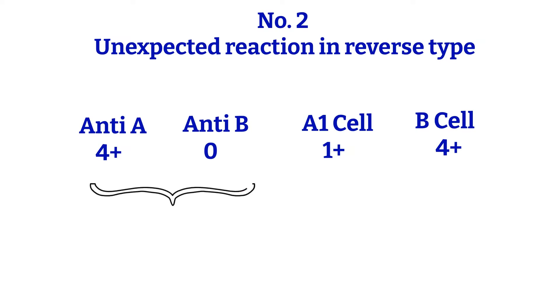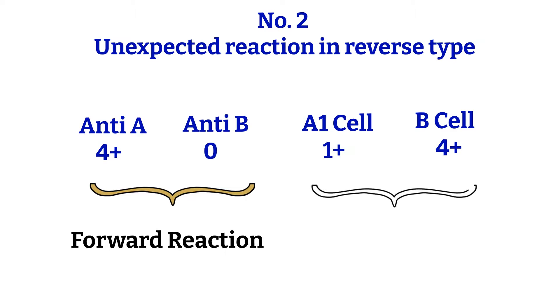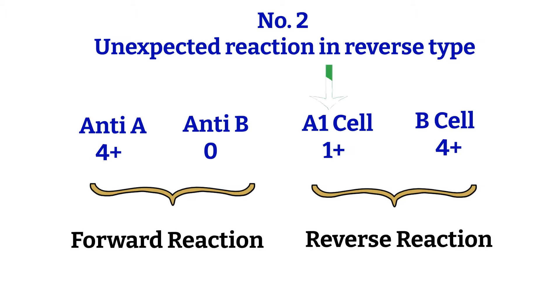I'll give you some hints. First, determine: is this a forward or reverse issue? Looking at the given reactions, you can see that the A1 cell has the weakest reactivity, and that is from the reverse reaction. Since the weaker reaction is in the reverse type, it is more likely that the discrepancy is in the reverse.